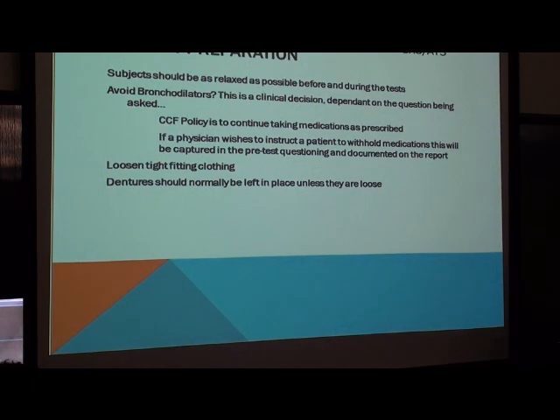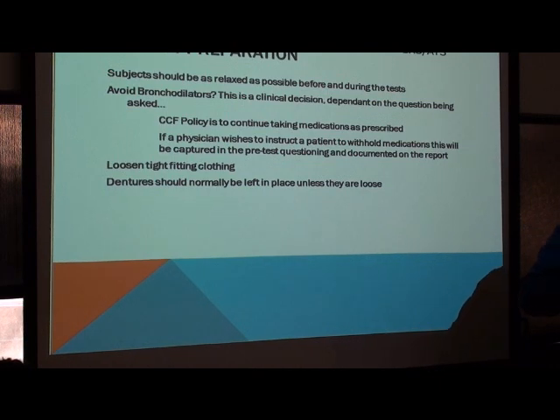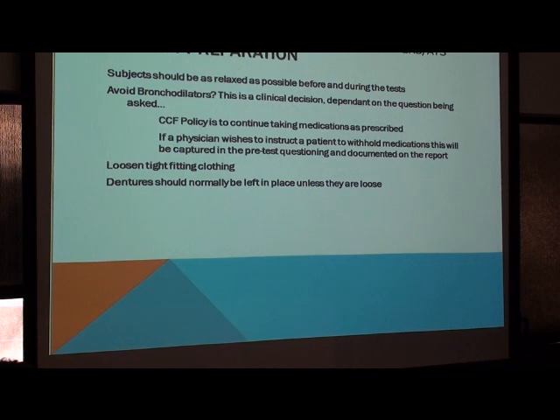At one point in time, we used to think of spirometry before and after bronchodilator, assessing bronchodilator response, as really key to making the correct diagnosis of the patient. And this goes back decades, folks. There was this thinking that really reversible bronchial spasm, that's asthma. And non-reversible bronchial spasm, oh, that's got to be chronic bronchitis or COPD. And the thinking along those lines has really evolved over the years to where we're using the test more for other purposes than saying, you know, this is key to making the diagnosis. There are other things that point you in the right direction as to what the diagnosis is.